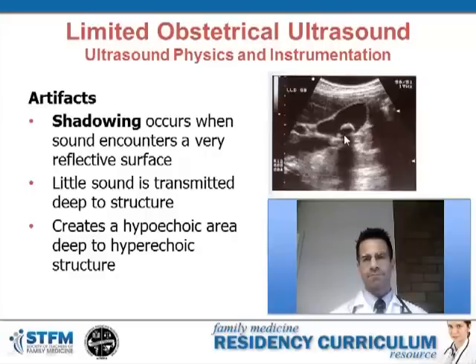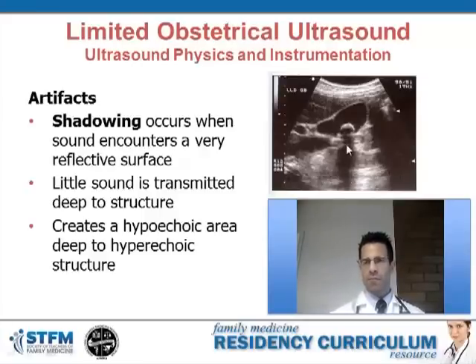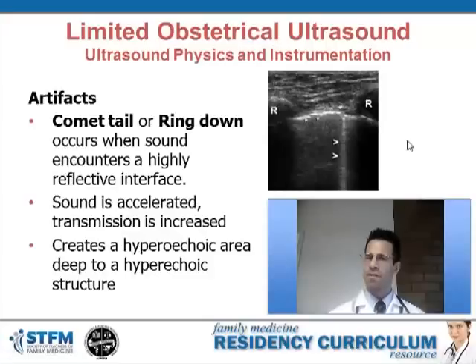Shadowing can be seen here — this is a gallbladder, and this is a gallstone. Shadowing occurs when sound hits a very reflective surface; there is little sound transmitted through the stone. So below or deep to the stone, there is very little sound that propagates, and that area below appears hypoechoic compared to surrounding tissue.